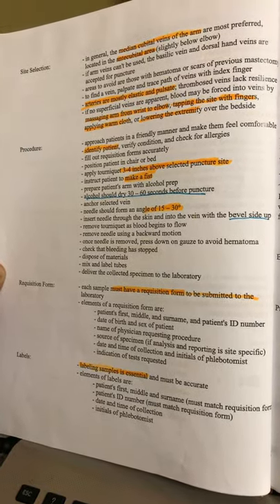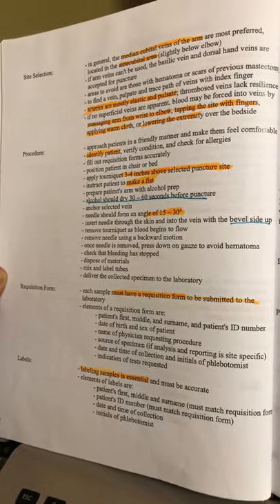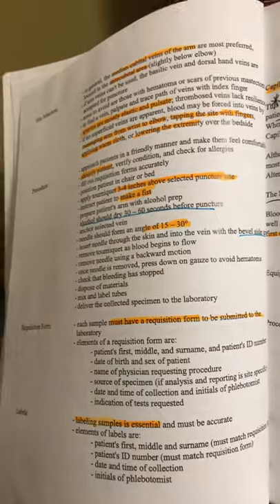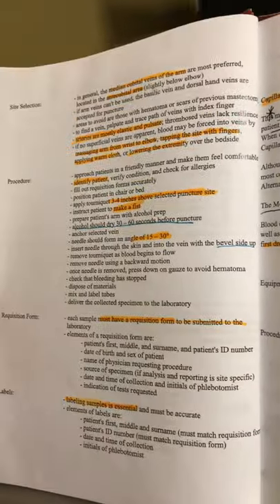Dispose of your materials. Mix and make sure you label. If you're not labeling these tubes, we'll be in big trouble. If you don't label them beforehand, something may happen.